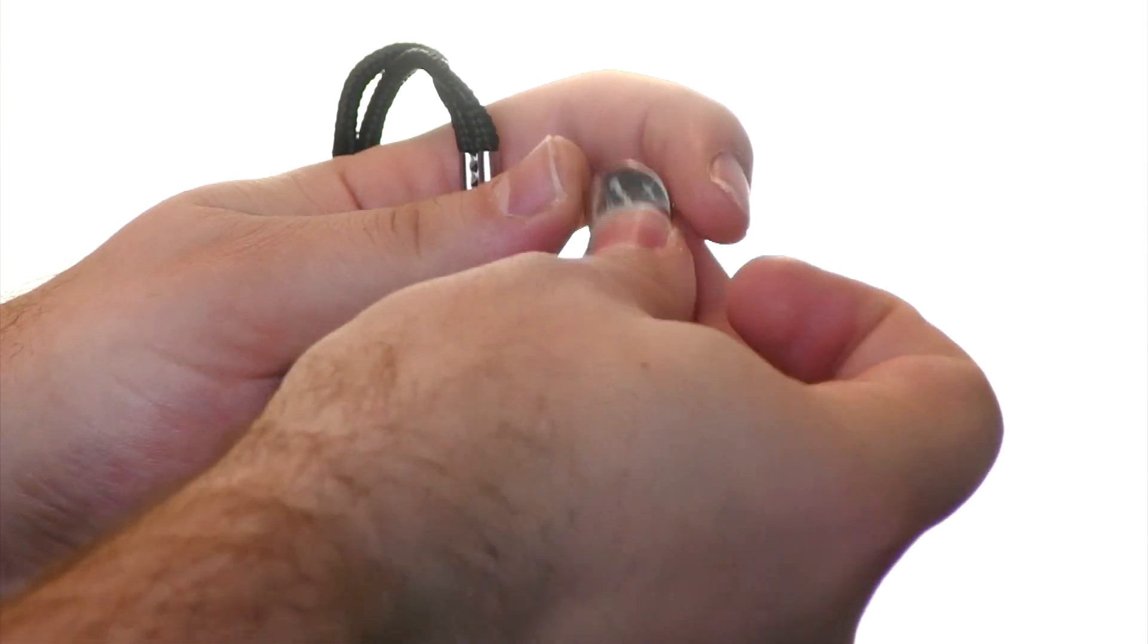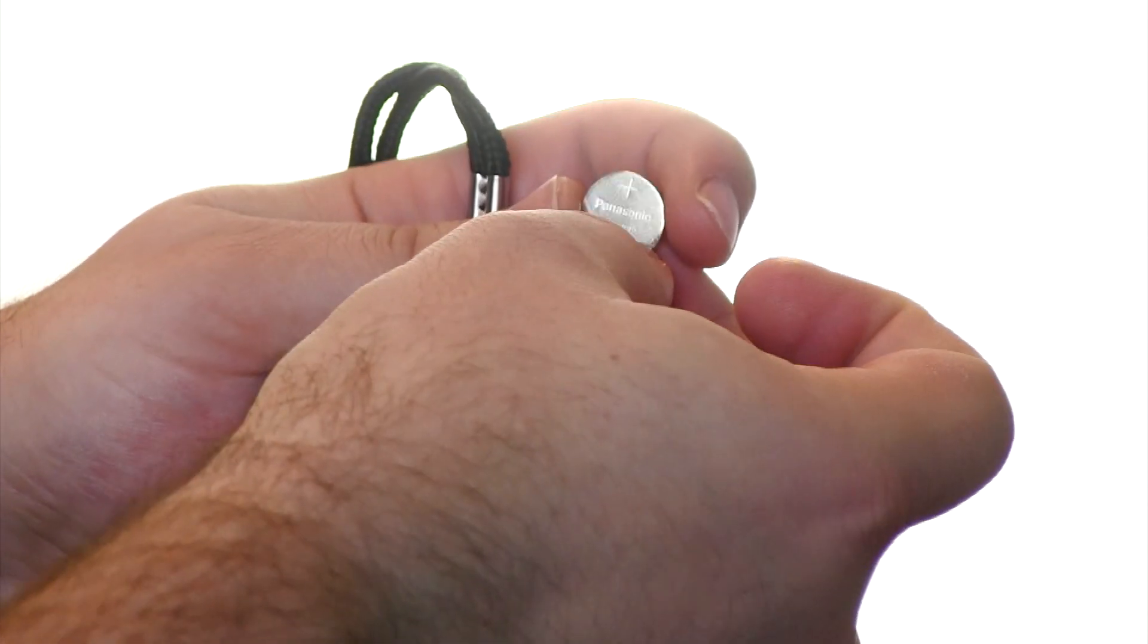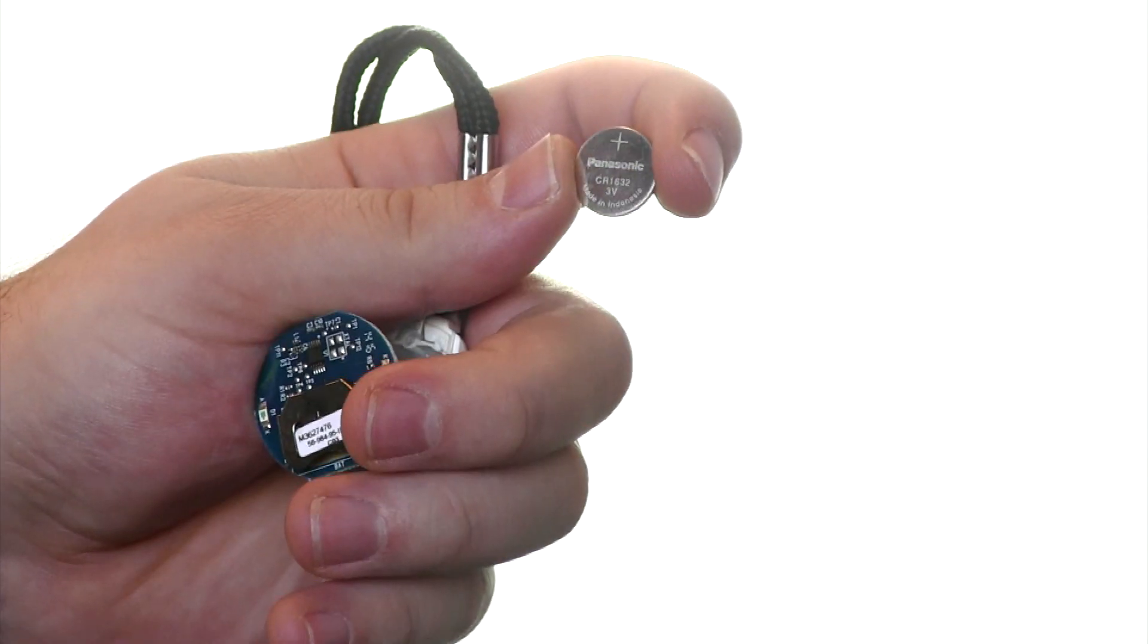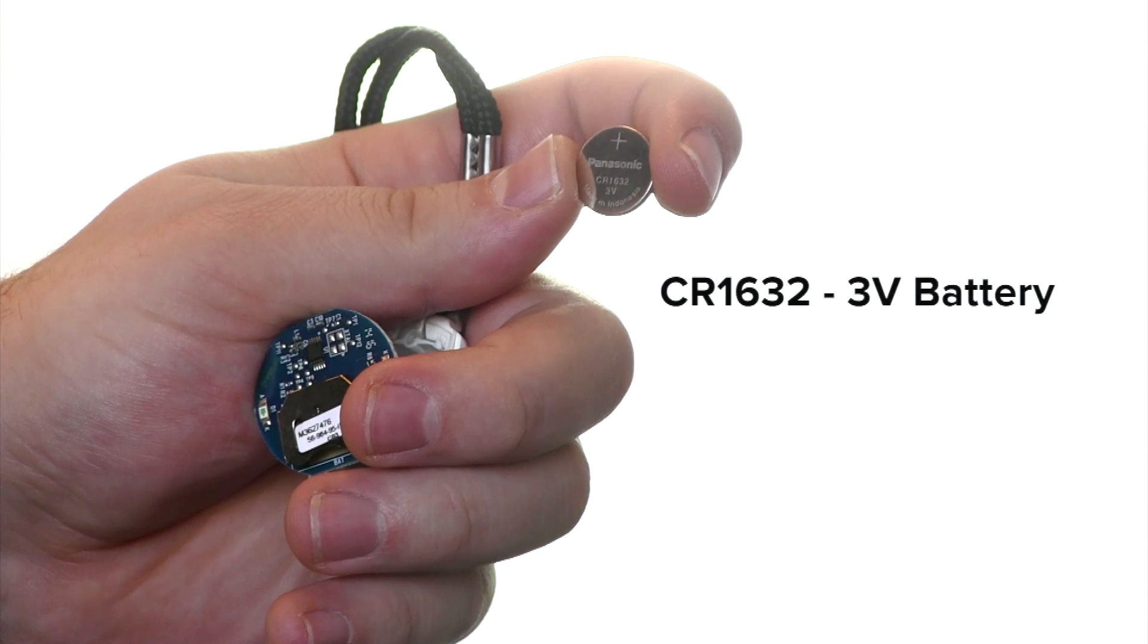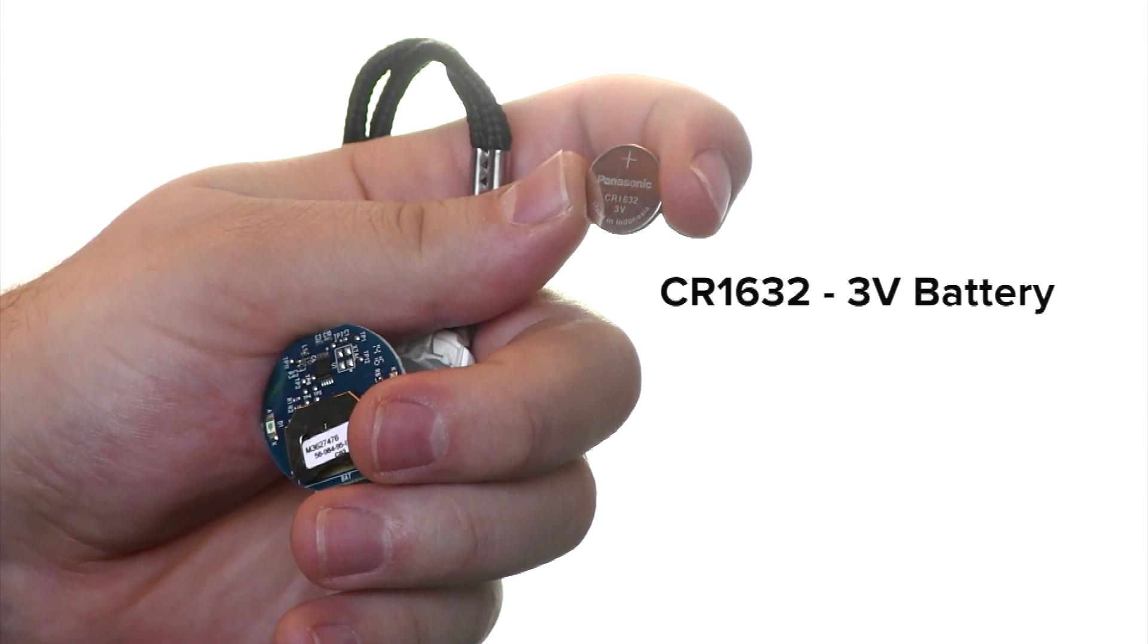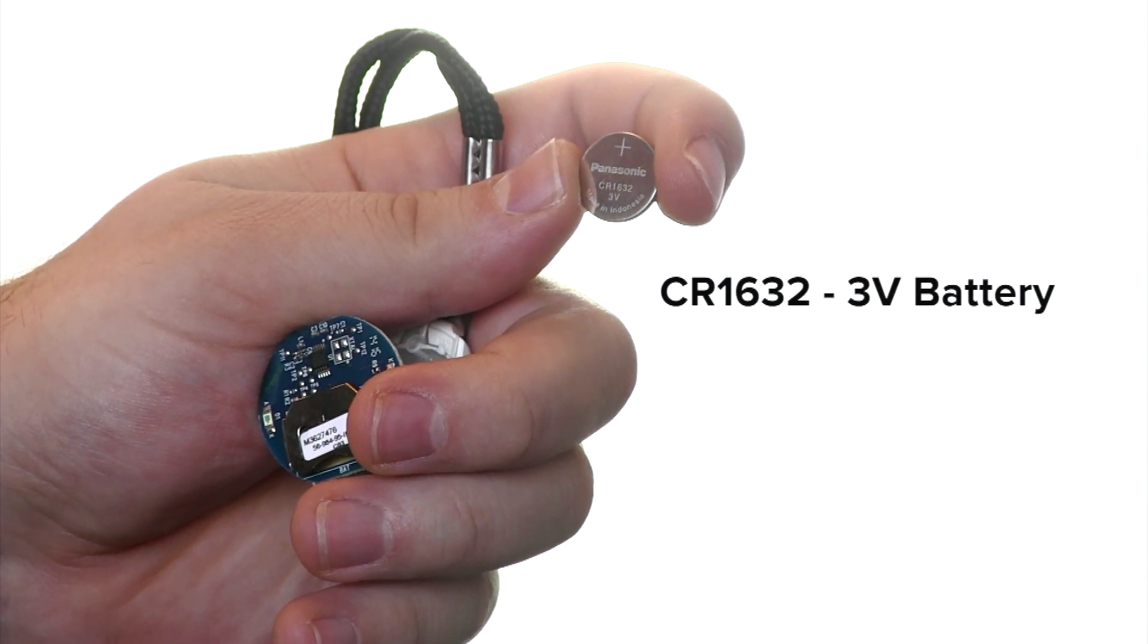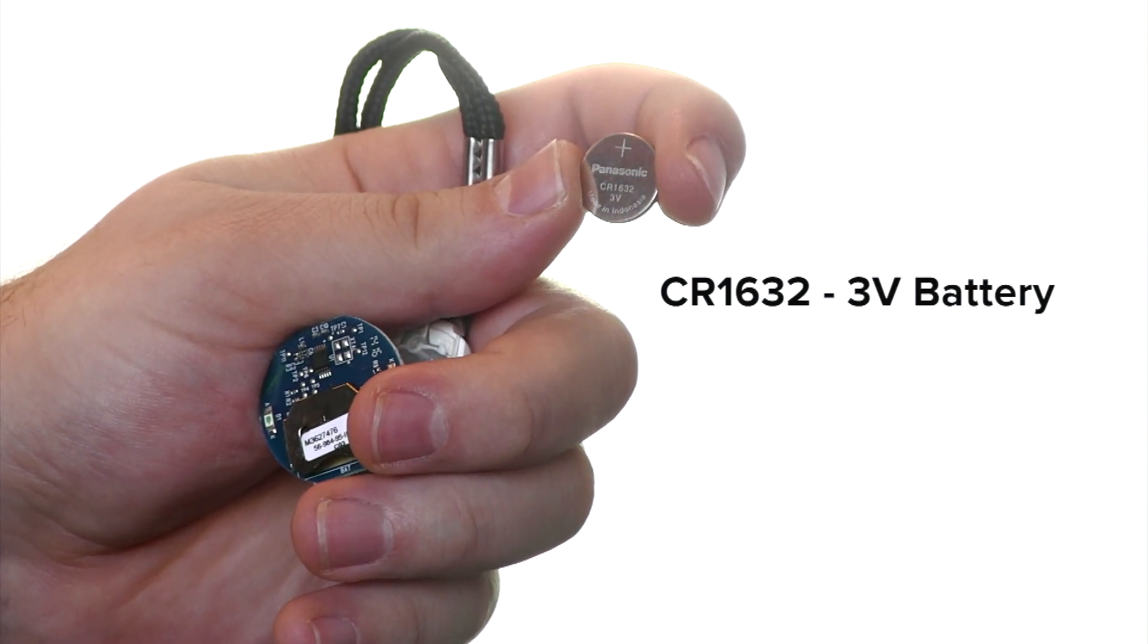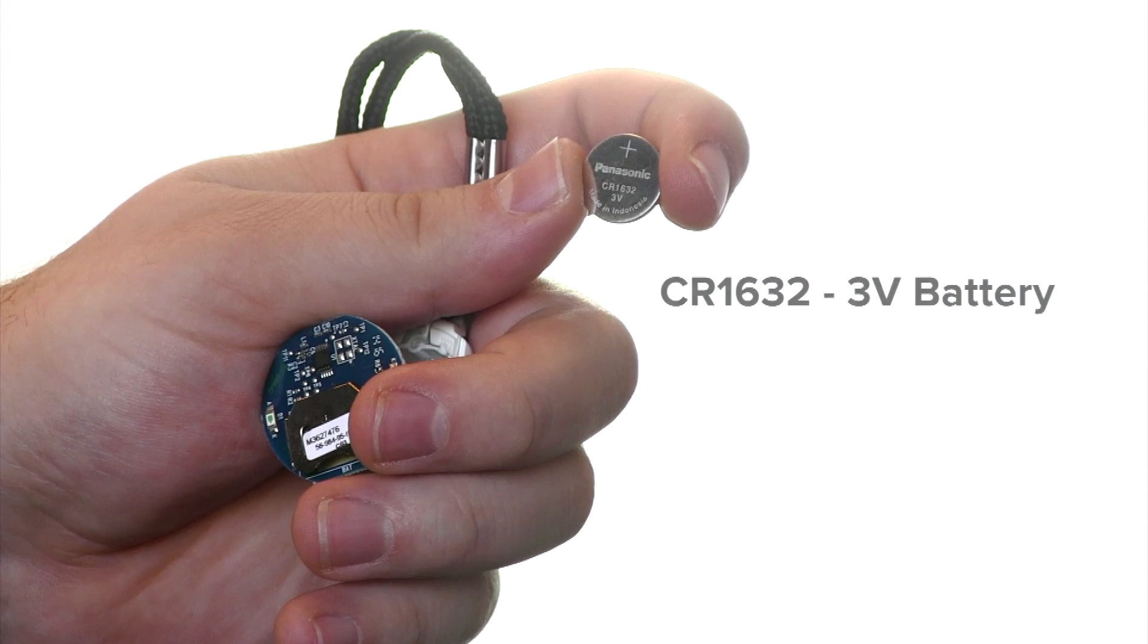This particular battery for this device is a CR1632 3-volt battery and can be found at most drugstores or bought online.